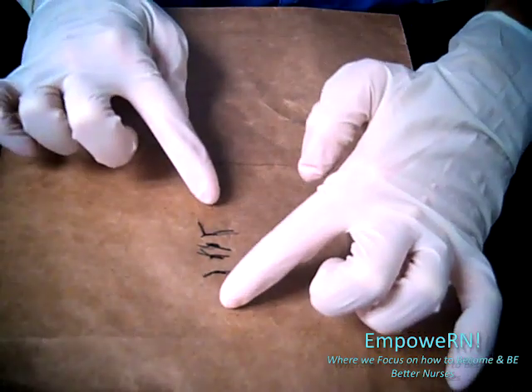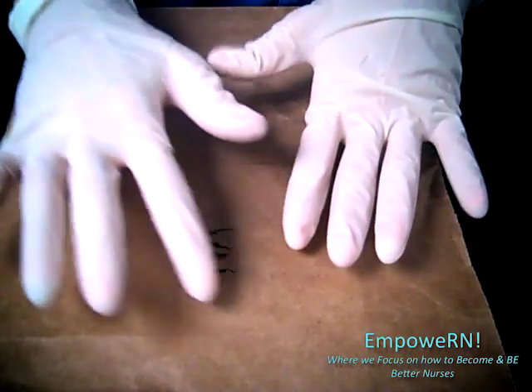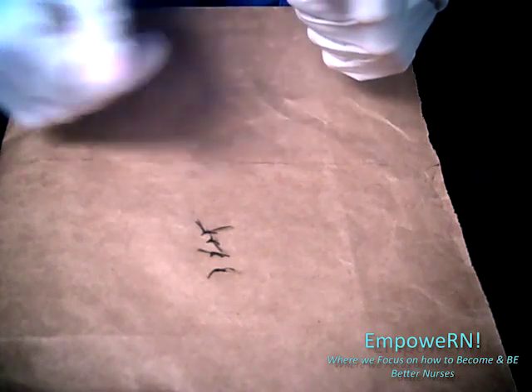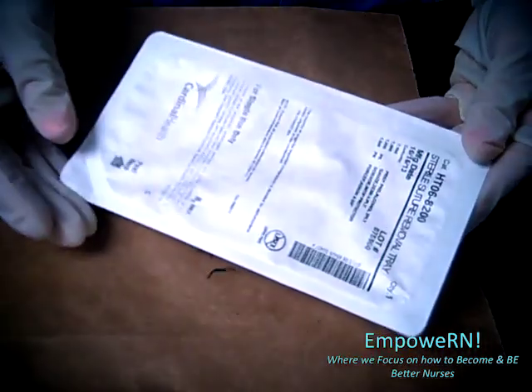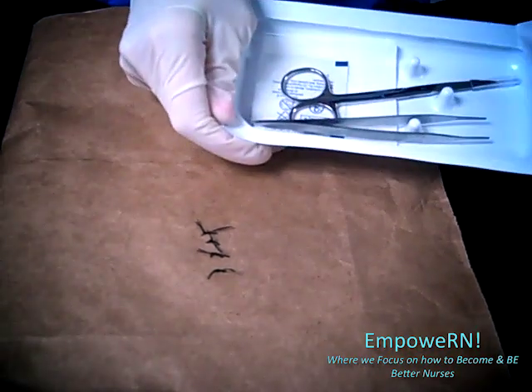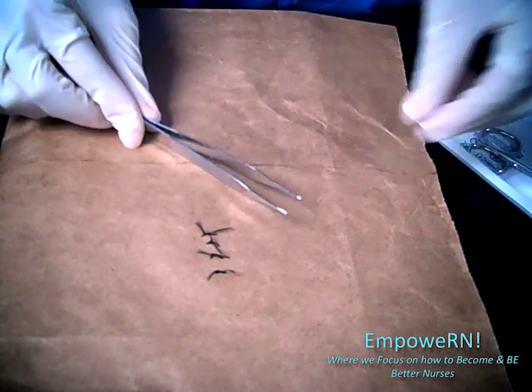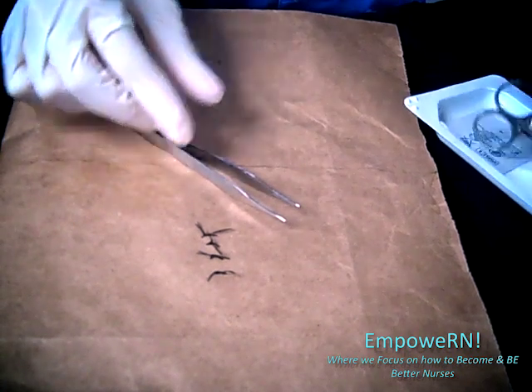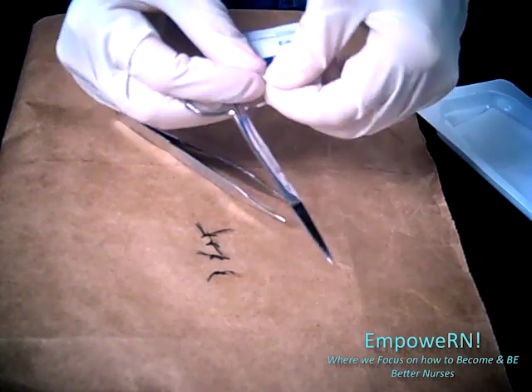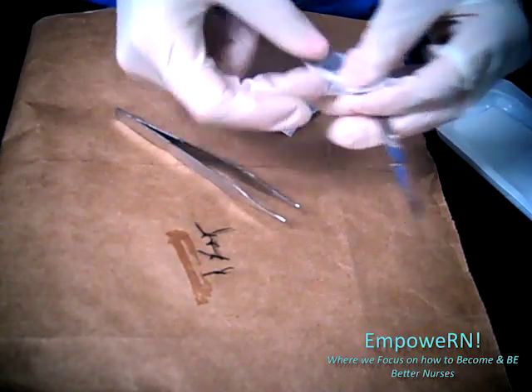What you want to do before you start is measure the actual incision and make sure there's no excessive redness — it should just be slightly pink and really should be intact. There definitely should be no bleeding, no pus, anything like that. Then you get a suture removal kit and open that up. In the kit you will find some tweezers, scissors, and some alcohol. You can rub the alcohol on there and make sure it's nice and clean.